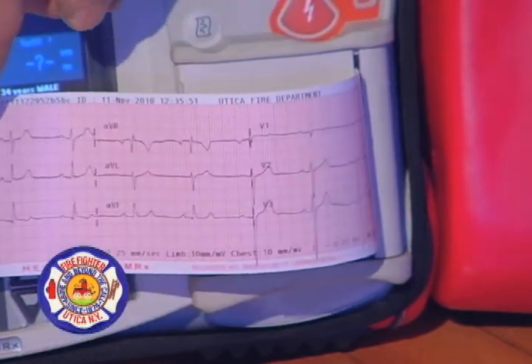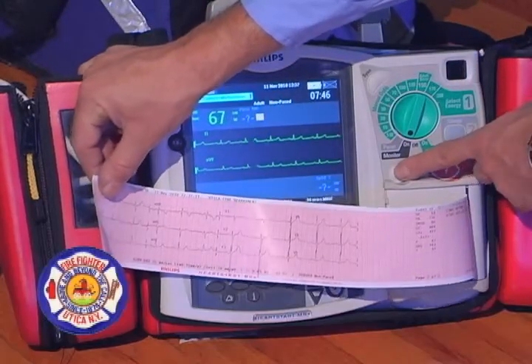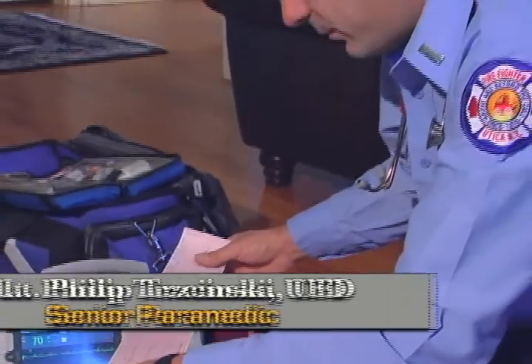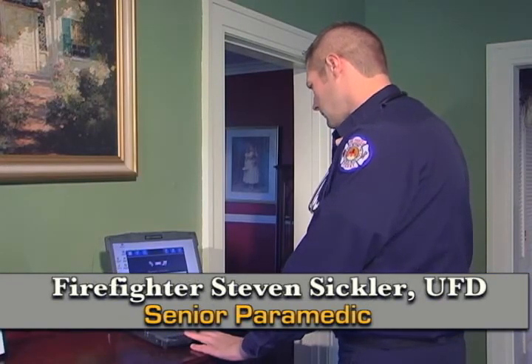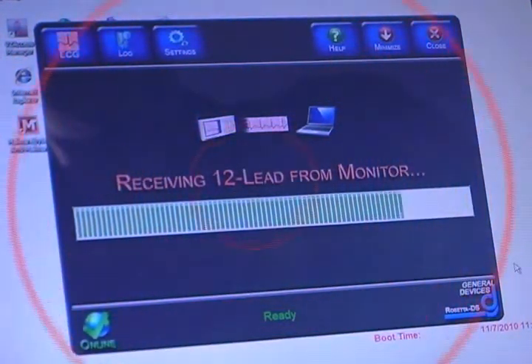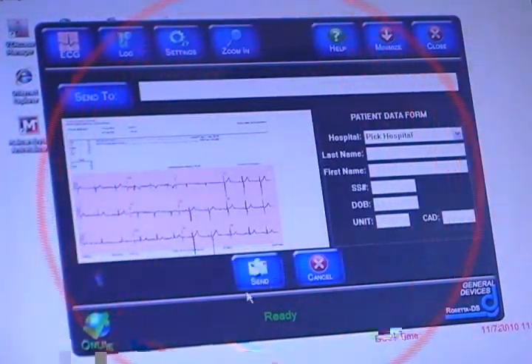What has developed over the years is when those paramedics come in, they realize that this is a heart problem, they take a picture of your heart with the heart monitor. Then that picture is actually transmitted wirelessly. There's no wires. It's transmitted wirelessly to the laptop computer. From this, via technology that I don't quite understand, this is transmitted to the hospital so that the doctors in the hospital, at a very short time after the picture is taken of your heart, can see that picture. They can concur, they can agree with the paramedics that yes, this is a heart attack happening and what we need to do about it. And the therapy is instituted a lot sooner.